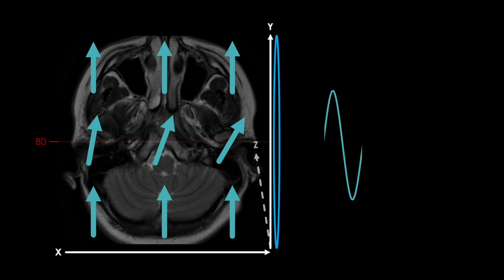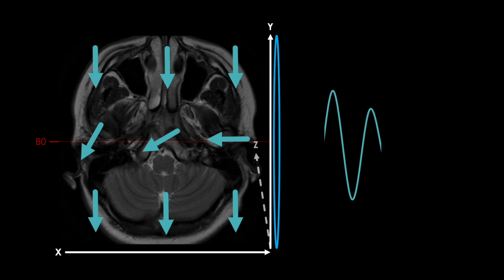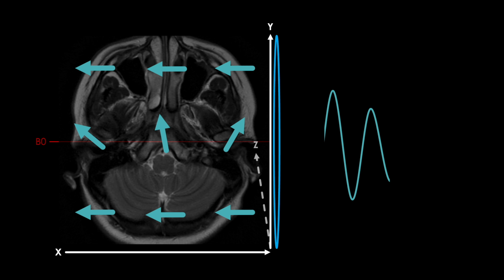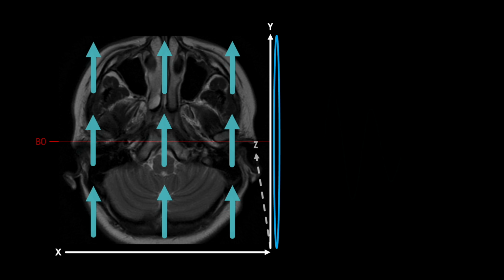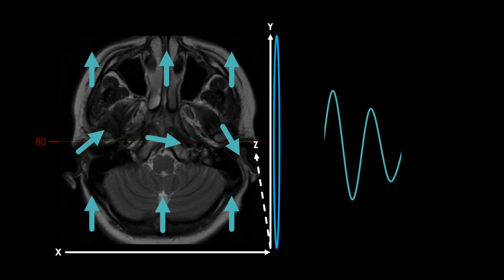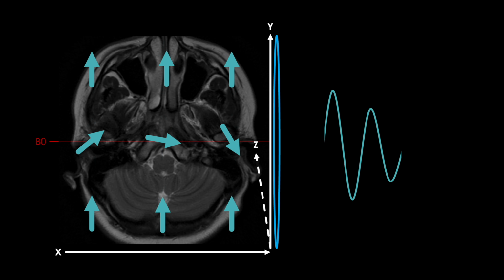So in order to keep things simple, we'll pretend these net magnetizations in the middle will start spinning at different rates. Let's see what happens to our signal now. You can see that the longer these spin at different rates, the more out of sync or dephased they become, and the smaller our signal gets. Just to compare, here is where we started. And here is where we ended up. Notice that the overall size of our magnets within each voxel got smaller, because the protons within it also undergo dephasing as time goes on.